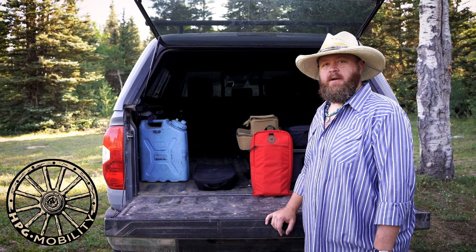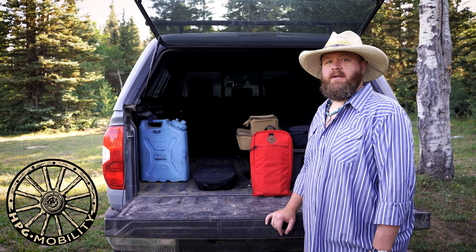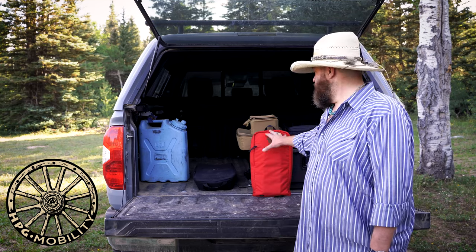I'm Scott Hill with Hill People Gear and I'm here to introduce you to a new piece of the mobility line, which is the Expedition Kit.